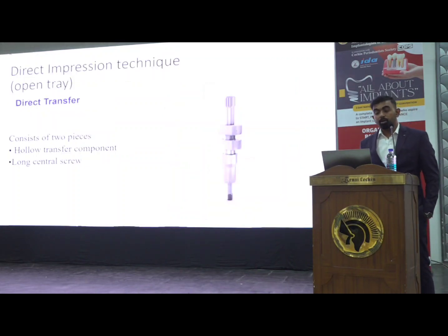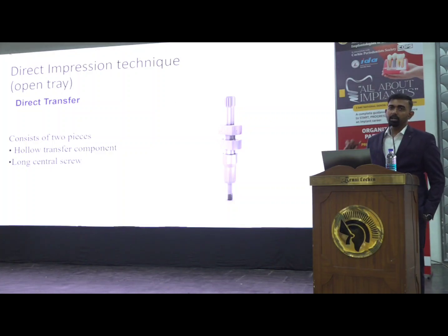And we'll discuss open tray impression technique. Open tray impression consists of two pieces: one hollow transfer component and a long central screw.